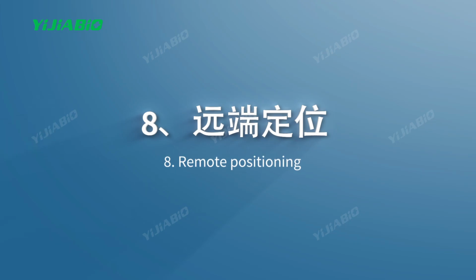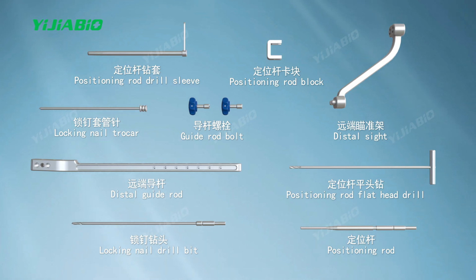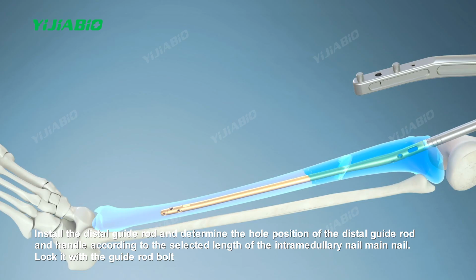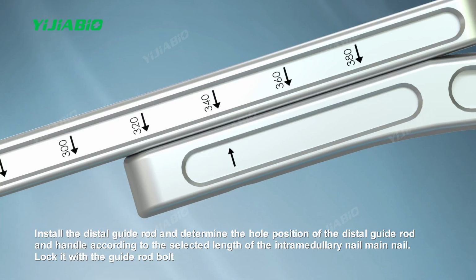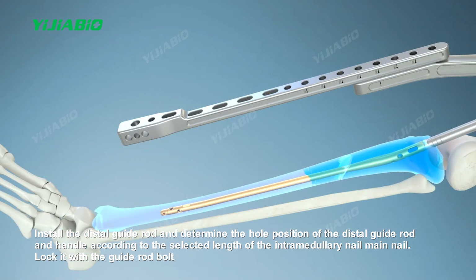Eight, remote positioning. Install the distal guide rod and determine the hole position of the distal guide rod and handle according to the selected length of the intramedullary nail main nail. Lock it with the guide rod bolt.